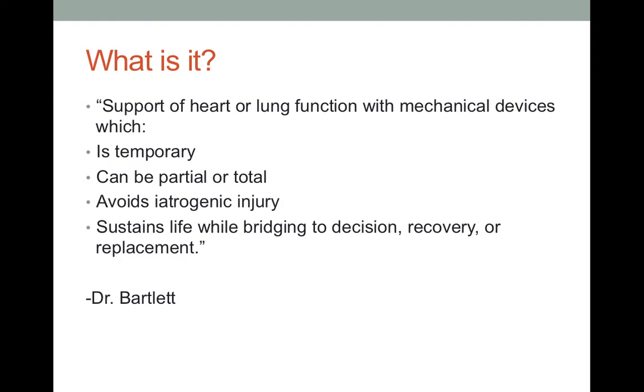So what is ECMO? In the words of Dr. Bartlett, ECMO is support of heart or lung function with mechanical devices, which is temporary, can be partial or total, and avoids iatrogenic injury, so you stop hurting the lung with the positive pressure ventilator.